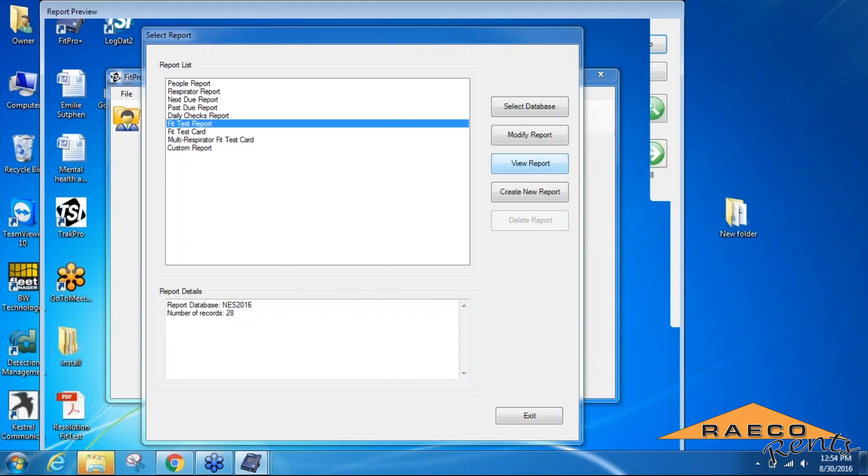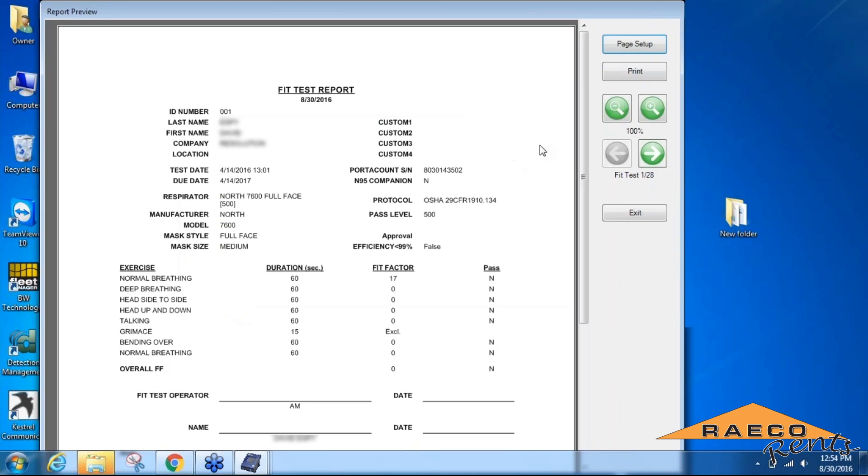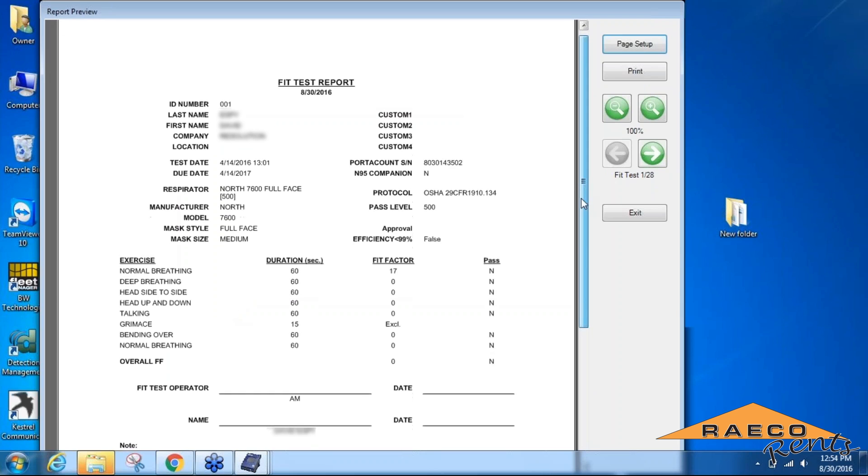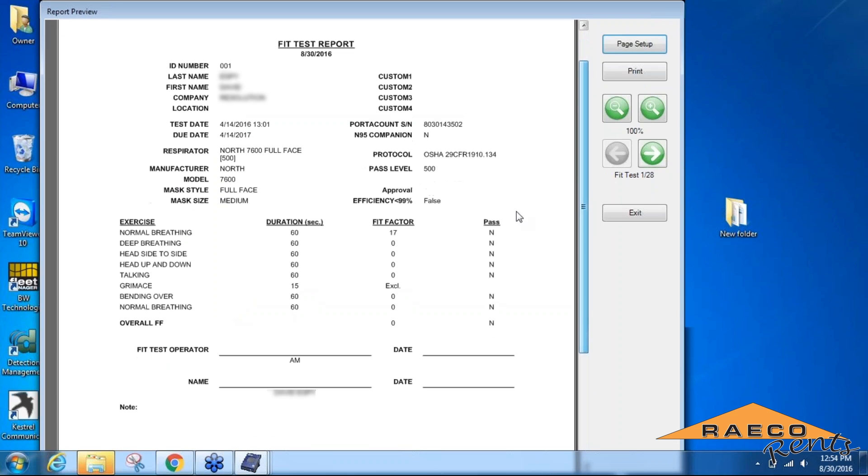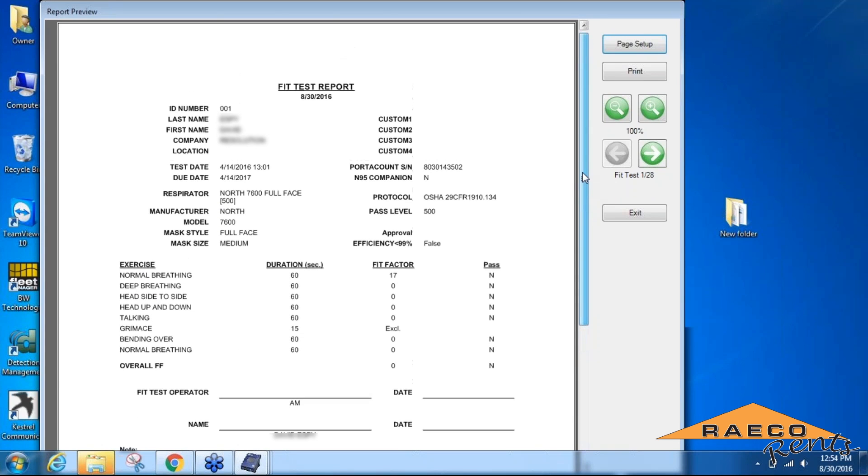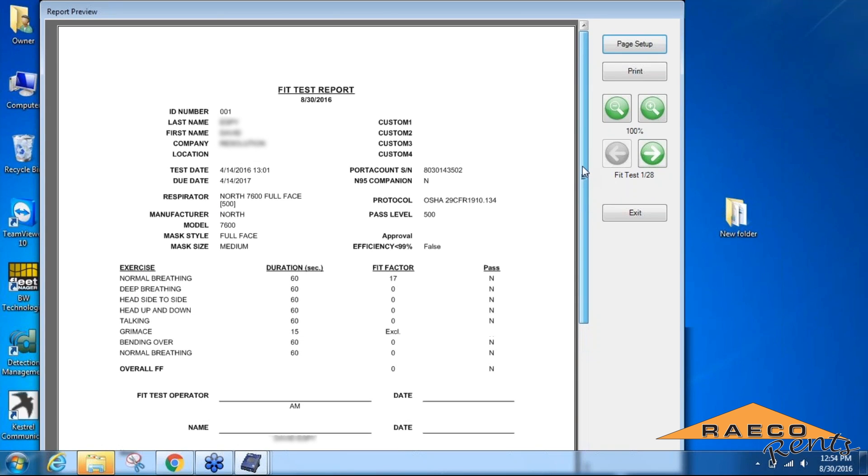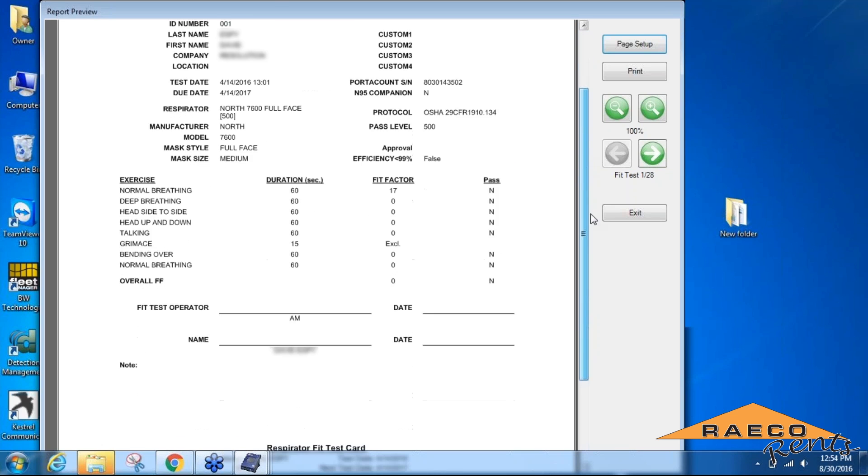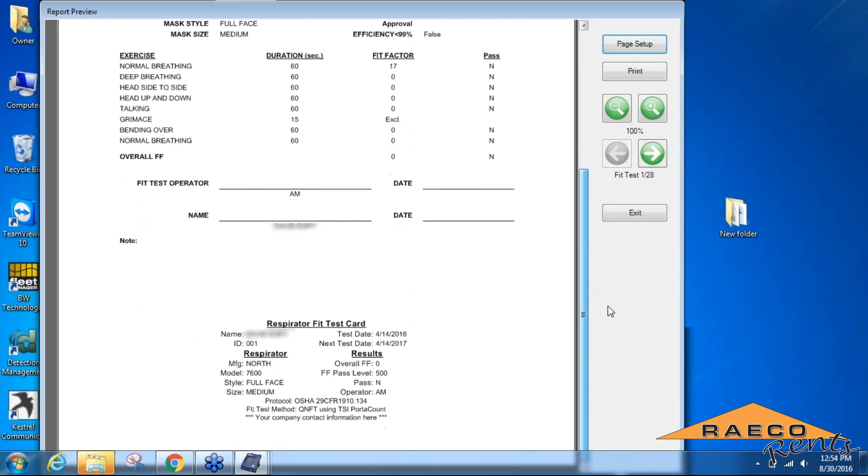As you can see, it shows you for each portion of the fit test what the result was, whether it passed or failed. It's got all the information about the user and the respirator on there, and includes a fit test card that a lot of people are looking for.